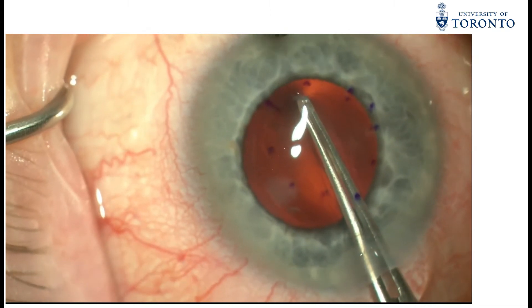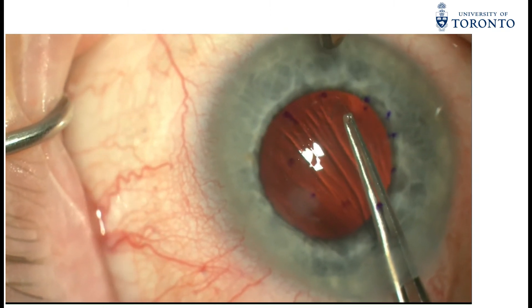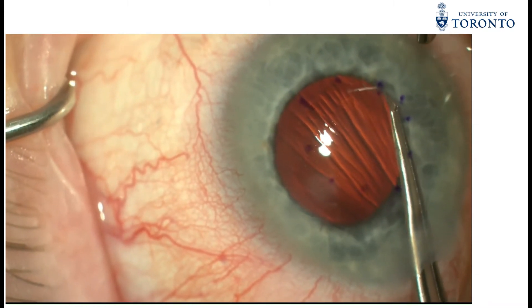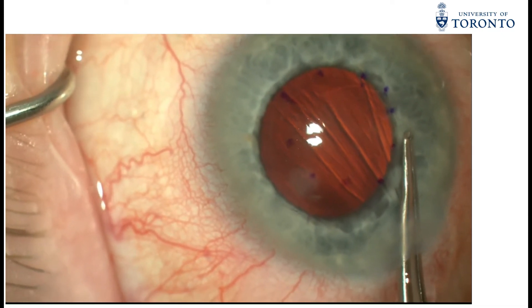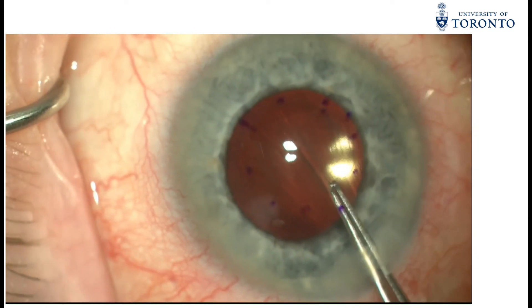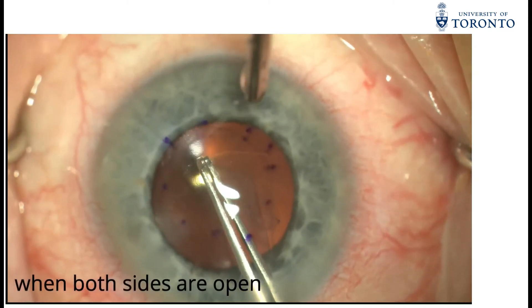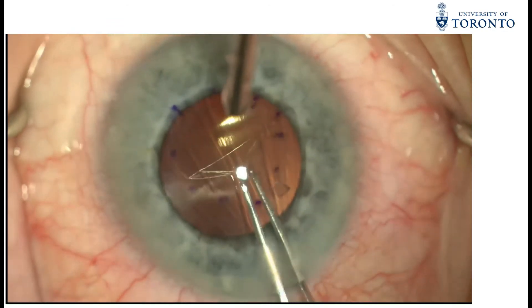With the opening of the flap, the flap is then re-held by the Gorovoi forceps and is peeled in a clockwise manner for another 2 o'clock hours. A 4 o'clock hour Descemet's crescent-shaped flap is then opened and pulled to the centre.